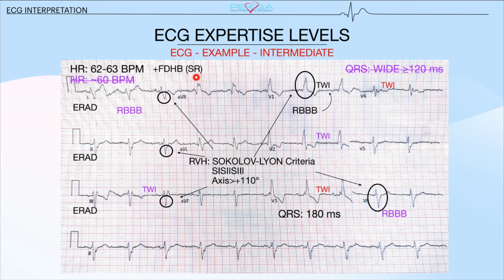They will be able to tell you that this is a sinus rhythm, where a beginner might be confused by what this is. They might not call this a sinus rhythm. They might just freak out. The QRS is no longer wide. It is extremely wide.